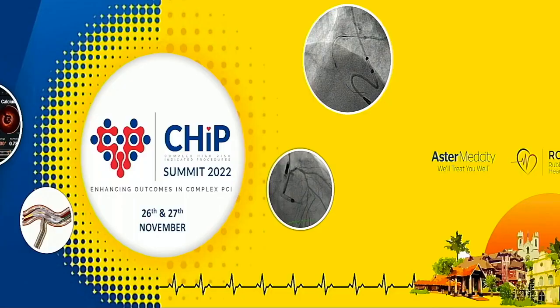And Deepak is good in Rota. I have the same disclaimer as that of Deepak sir, no direct experience. But my understanding is laser has been around for some 30 years now. But despite Samin Sharma sir presenting yesterday, even now in the US the penetration is 1 to 2% of total calcific lesion therapy. So the subsets I could find: one was when the lesion is not crossed. Even then, the laser needs to just sit on the lesion, not cross. In such situations, this will work. Second, like IVL, this does not damage the stent, so an underexpanded stent is another one.